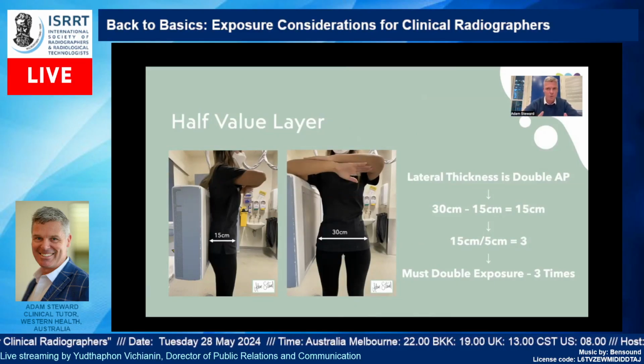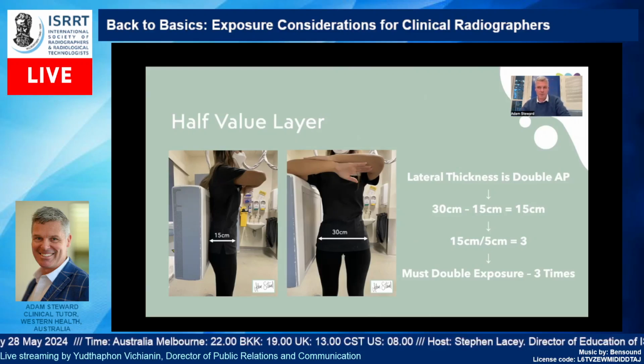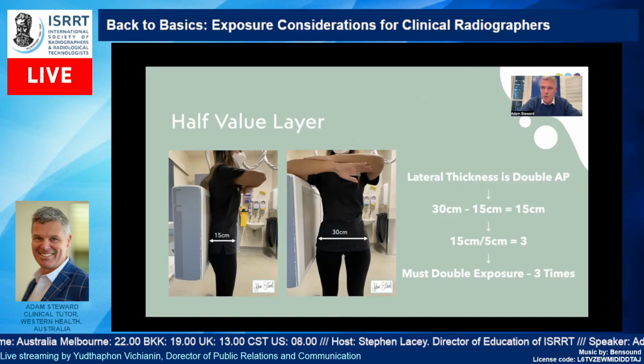Now, with the digital systems, you've got much better latitude, so you may not need to go quite that heavy-handed, but certainly if you just double it, it probably won't be enough. You'll still have a noisy image. You may need to go again and repeat again, which is going to create a whole extra dose to the patient that's unnecessary if you understand how to use this a bit better, okay?